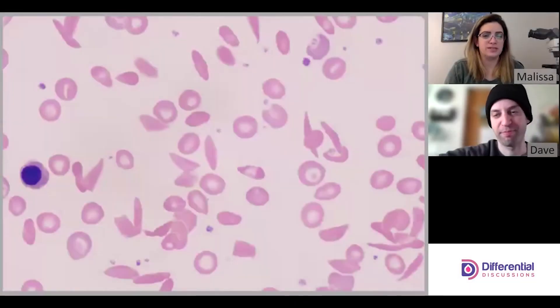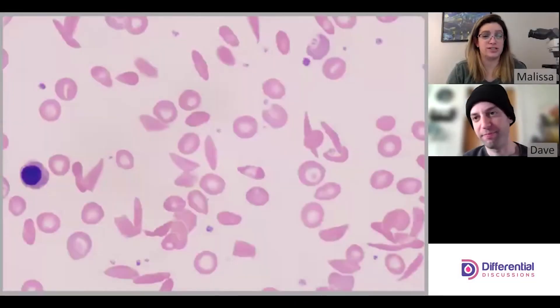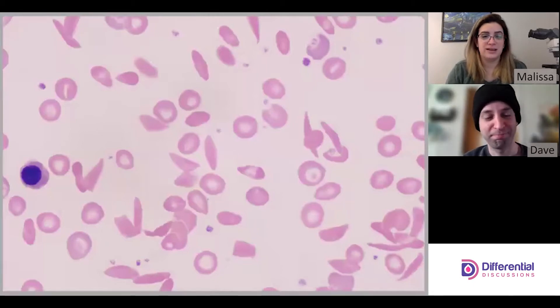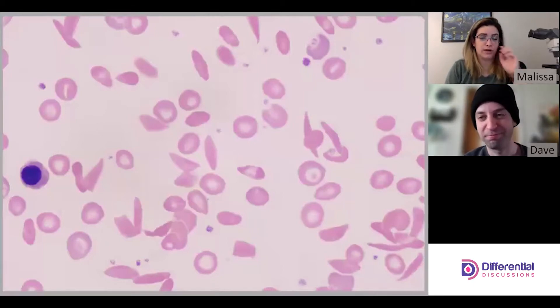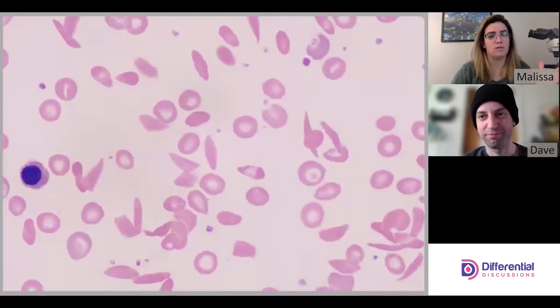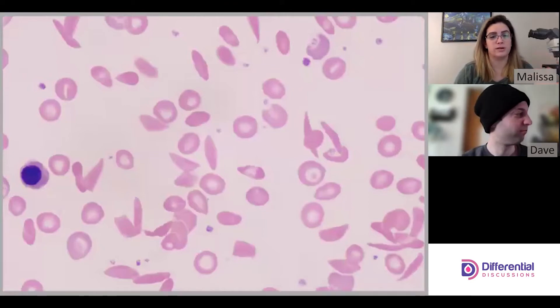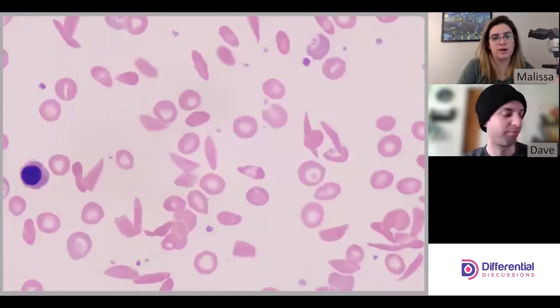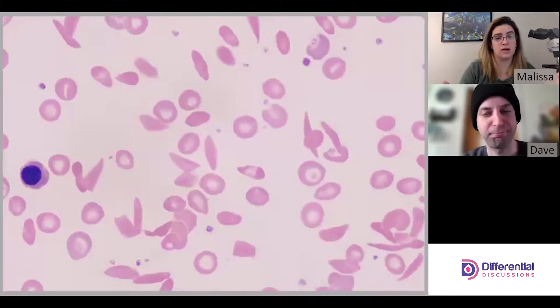Hello and welcome to Differential Discussions. I'm Melissa, I'm Dave, and in this video we're going to show you how to correct the WBC count for the presence of nRBCs.